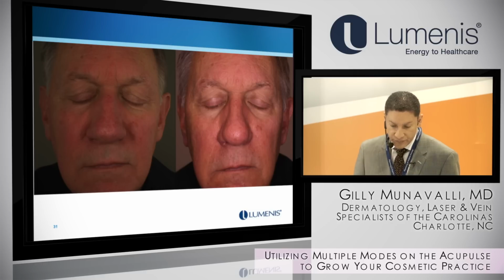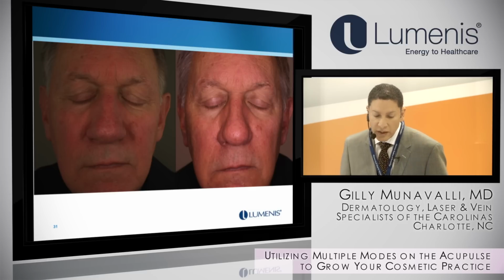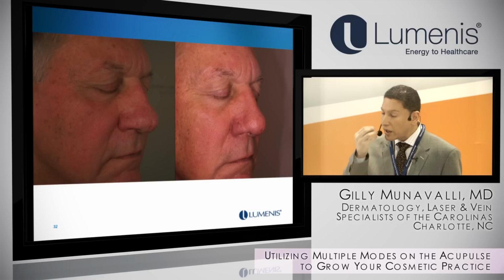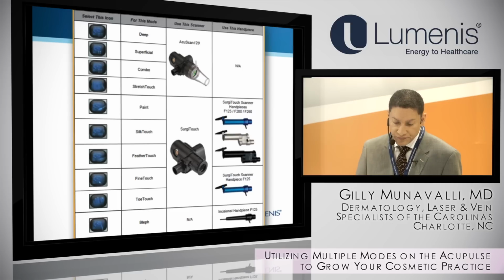So this is an example of a gentleman who has rhinophyma, and this was a recent patient, probably about 3 months ago. And you can see a reduction in the nose. Again, we used the combo mode to sculpt and wipe and then contract the skin. So you see he's got a lot better contour of his nose than he had before. So you have a lot of flexibility with this mode.